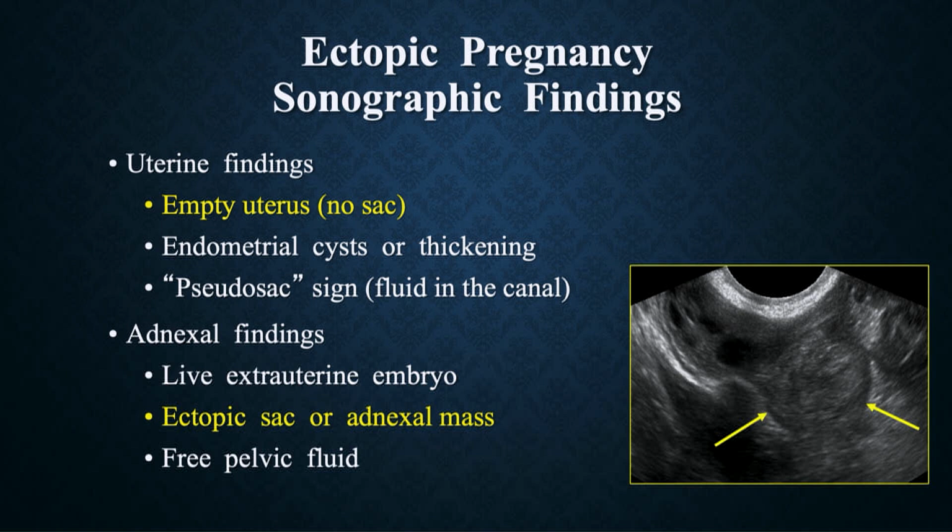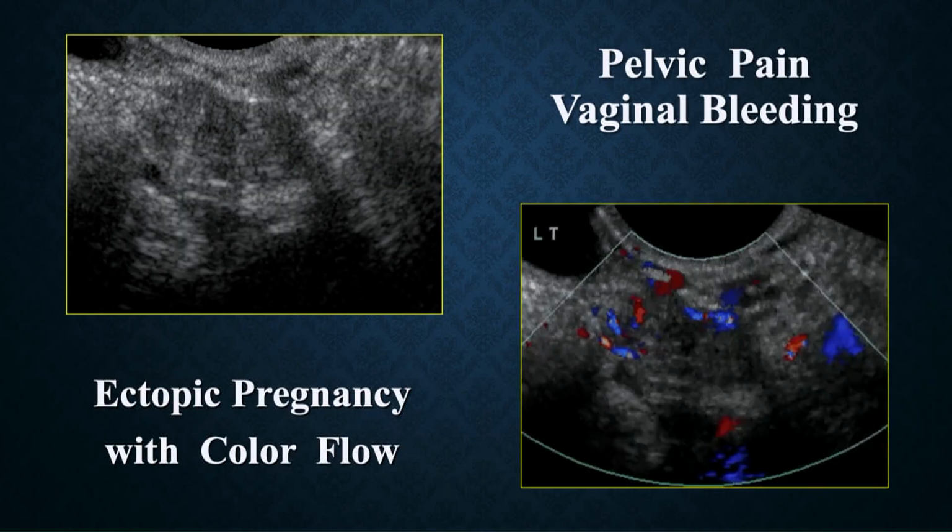And of course, we're looking for free pelvic fluid. Obviously, a small amount of fluid isn't that helpful because it could be from the corpus luteum, but if we see a pelvis full of blood, then we know.